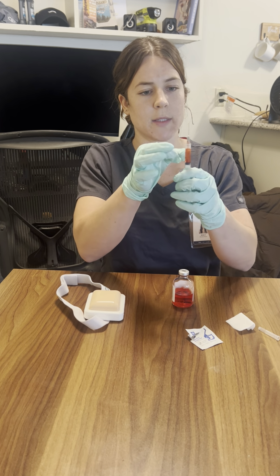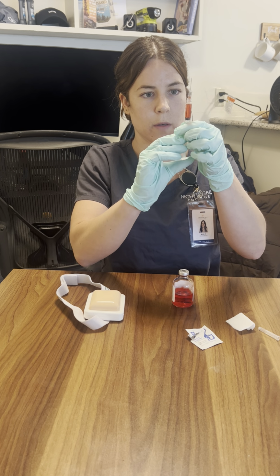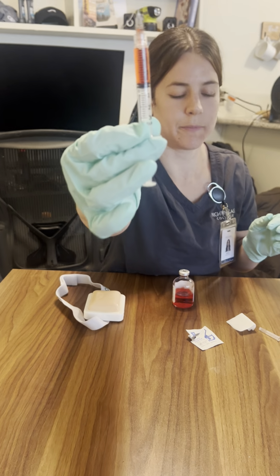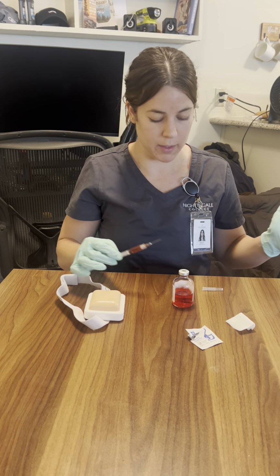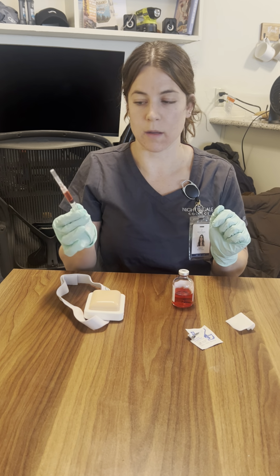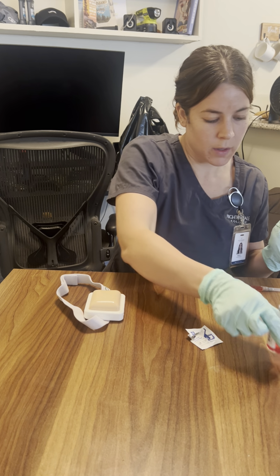After I've done that, I'm going to tap to get rid of the air bubbles. And I'm going to confirm. So 1.5. Since I need to get the patient prepped, I'm going to carefully recap the needle by scooping it. I will write the medication and the dose and set it to the side to get prepped.